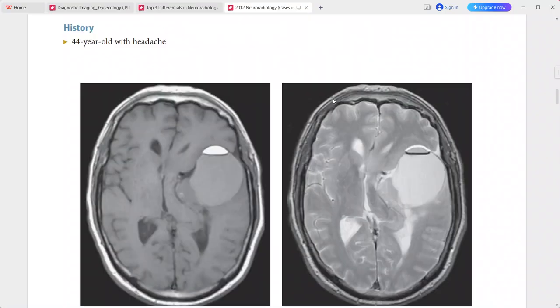This is a dermoid cyst. Differentials include teratoma, craniopharyngioma, lipoma, and epidermoid cyst.